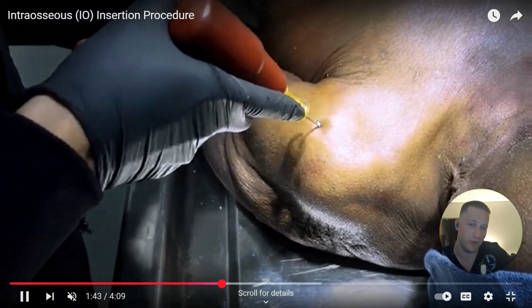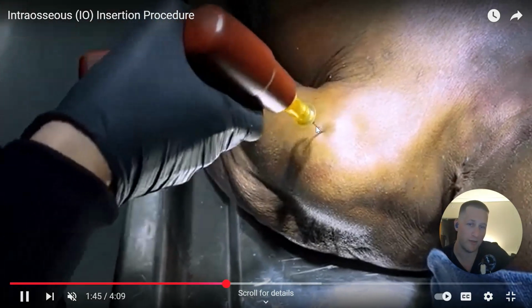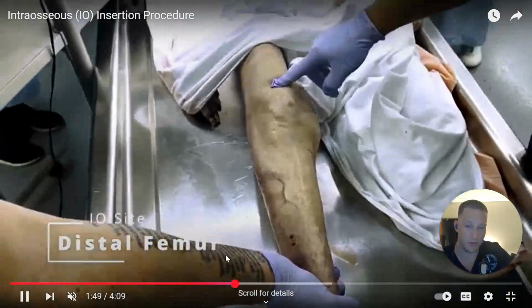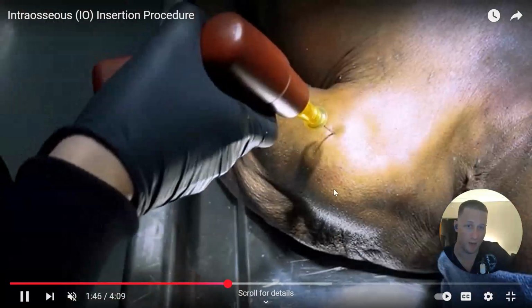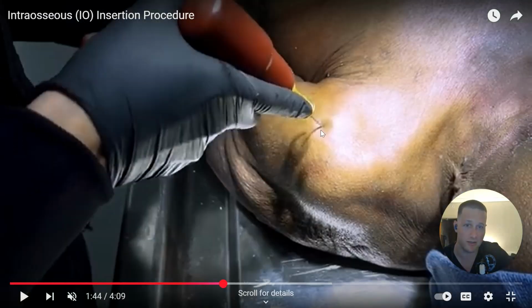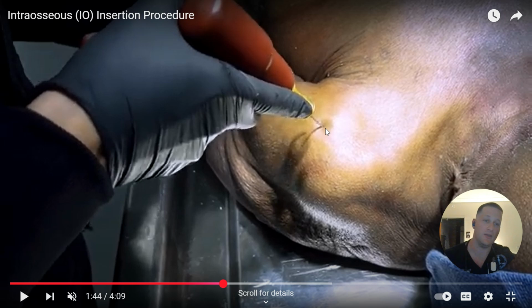So basically, what you want to do is you put it down on the bone, and then you give it a little wiggle. He did it right there. That's literally directly what I do. I give it a little wiggle. I don't just gun. Because what's gonna happen if you just go down, and as soon as it's through the skin, you gun, is you're gonna gunk up all that tissue along the needle, and it's going to get caught up and stuck in there. So don't just gun the second you stick it into their skin.